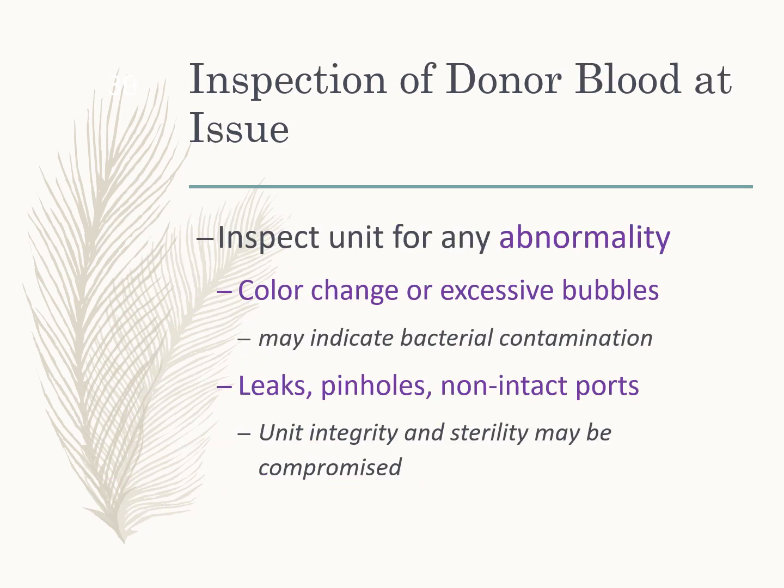So at the time of issue, that donor unit must be inspected. You want to look for any abnormality, a color change, bubbles. Sometimes if a unit has bacterial contamination, that'll cause strange colors or bubbling. Also any leaks or leaking ports. If something is leaking, the sterility is compromised.